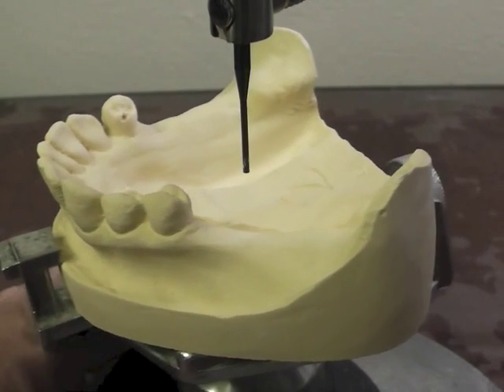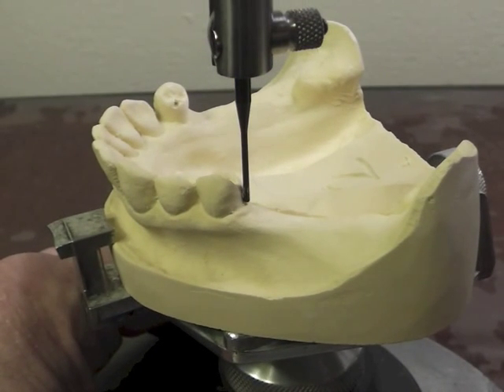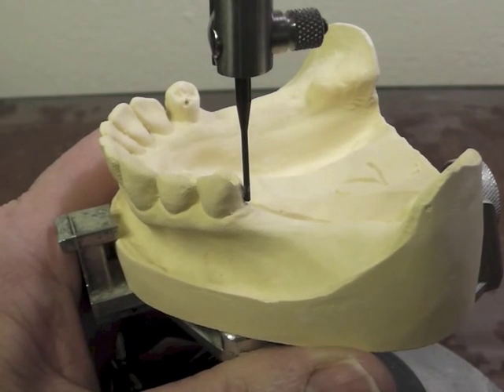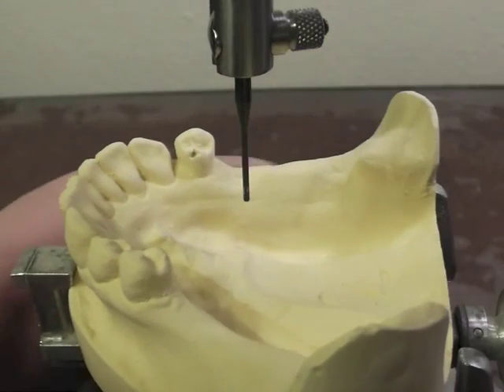Then we're going to first look at guiding planes. When I hold this surveyor analyzing rod up against the guiding plane area of the tooth, it looks relatively parallel.